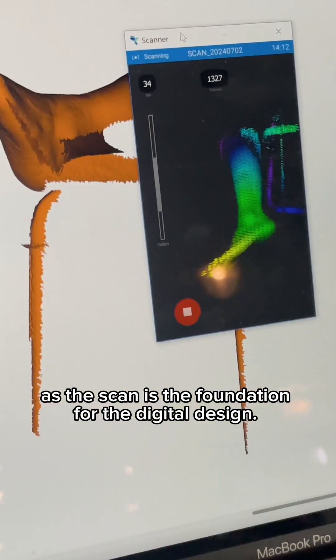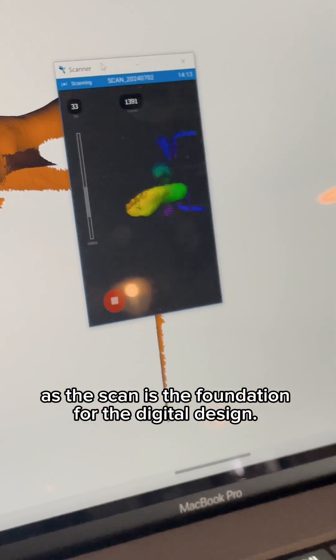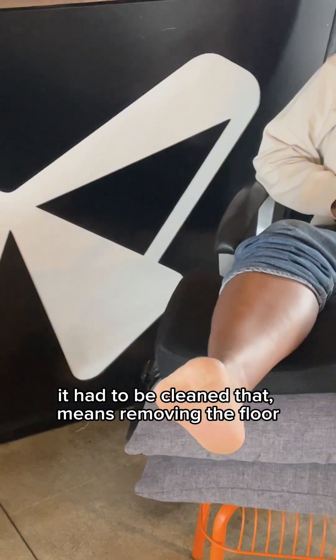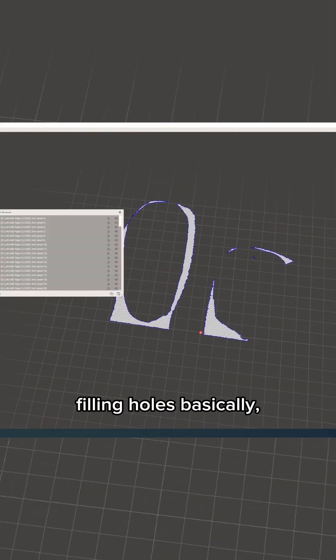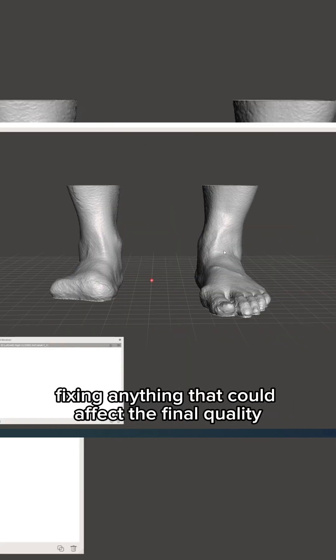We started with a 3D scan of the foot, as the scan is the foundation for the digital design. But before we could start modeling, it had to be clean — that means removing the floor and other irrelevant scan data, filling holes, basically fixing anything that could affect the final quality.